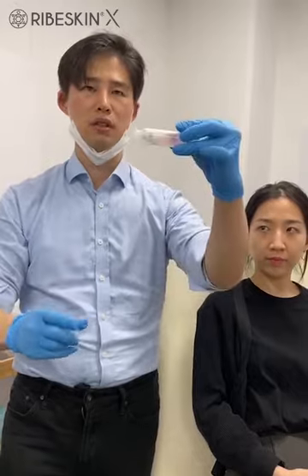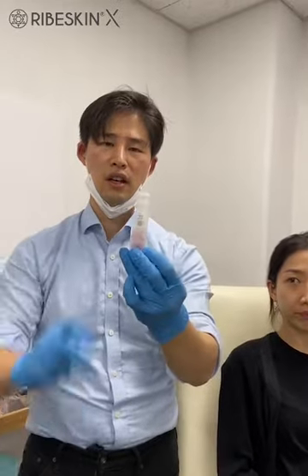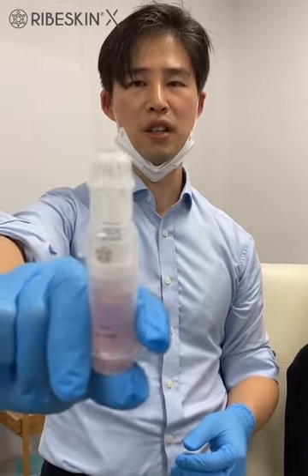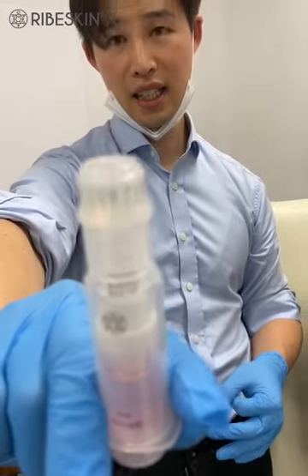How do we assemble? Just prepare both the device and attach it, then screw it. That's it. Before the procedure, remove the air from the fluid at the top of the multi-needle, just before it is expelled from each of the 19 needles.